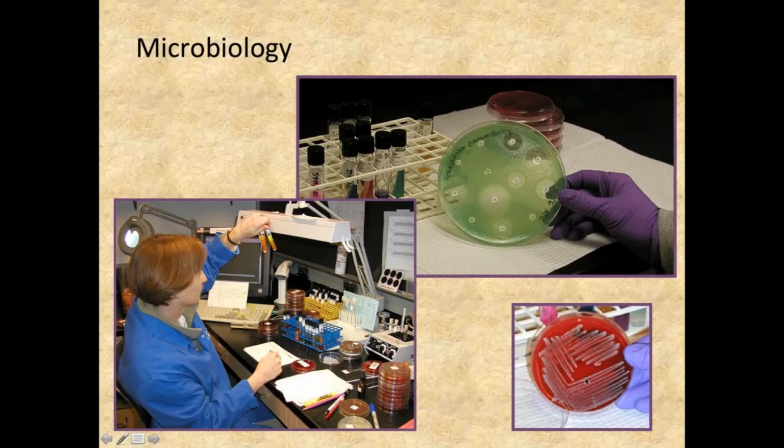In microbiology, we work with microorganisms, and we work with cultures. Very frequently, these come to us on a swab. It could be a simple throat swab looking for strep throat in a child. It could be a wound swab from a patient who's had surgery and the wound is now infected, or a traumatic wound that has become infected. We get a variety of samples in the microbiology lab.